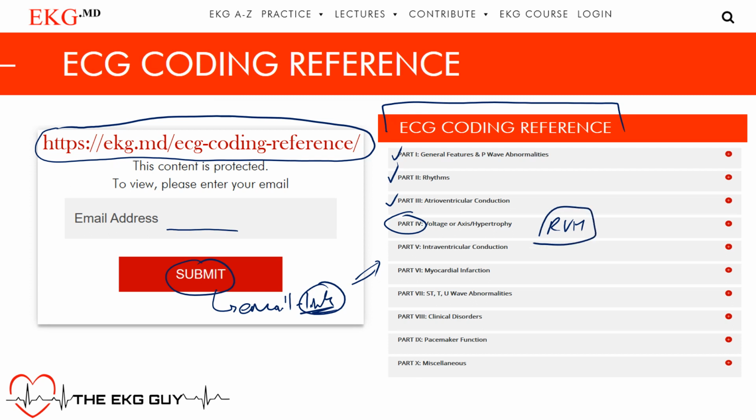Okay, so this is one that I think you'll find very helpful. It's sometimes hard to identify EKGs like this, and we recently just had one that I'll have to show in another lecture. That was quite interesting.